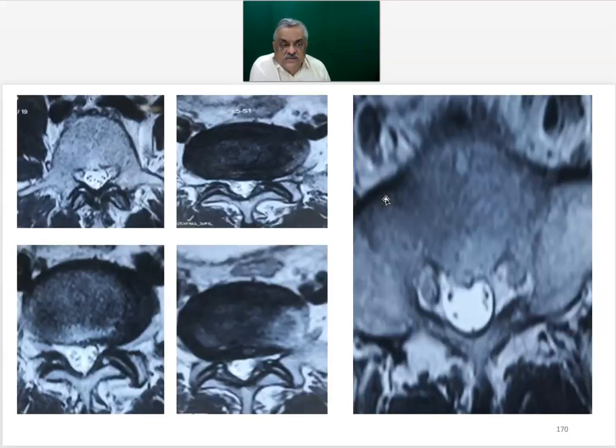Now here we will see this is the pedicle above L5-S1, there is the disc, there is asymmetry, there are some changes in the foramen on the right, and there is the lateral recess where you see the body of the vertebra, pedicle, and you see that this looks like that Mickey Mouse where the face and these two nerves are in the lateral recess.